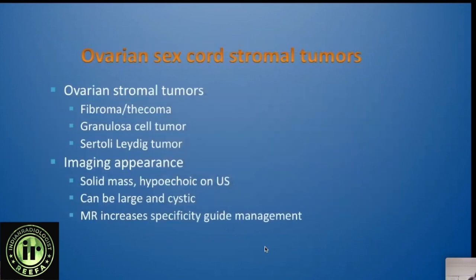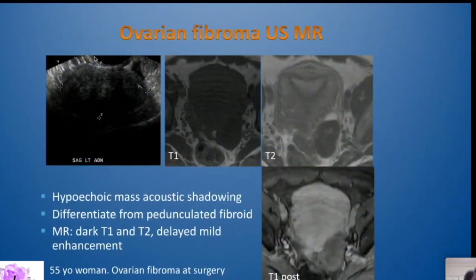Ovarian fibroma is part of the ovarian sex cord stromal tumor group, which are less common and include fibroma, thecoma, granulosa cell tumor, and Sertoli tumors. They can be solid and hypoechoic, or large and cystic, particularly granulosa cell tumors. MRI increases specificity and helps guide management. Another fibroma example: hypoechoic mass with acoustic shadowing, dark on T1, dark on T2, with some delayed mild enhancement post-contrast — confirmed at surgery.